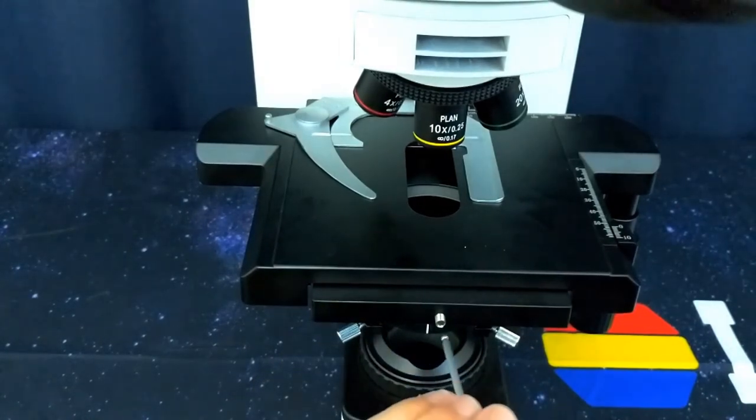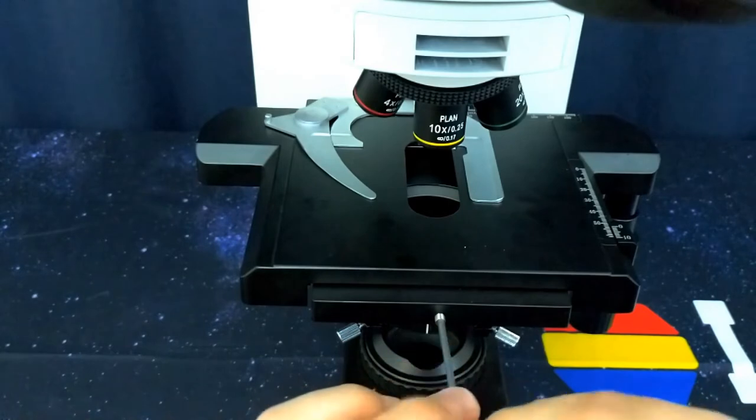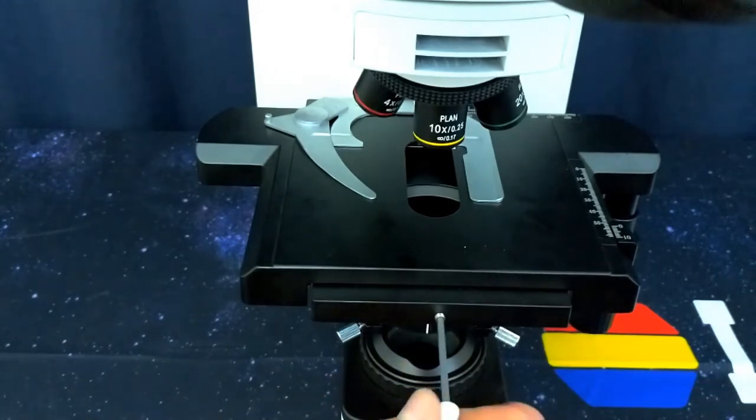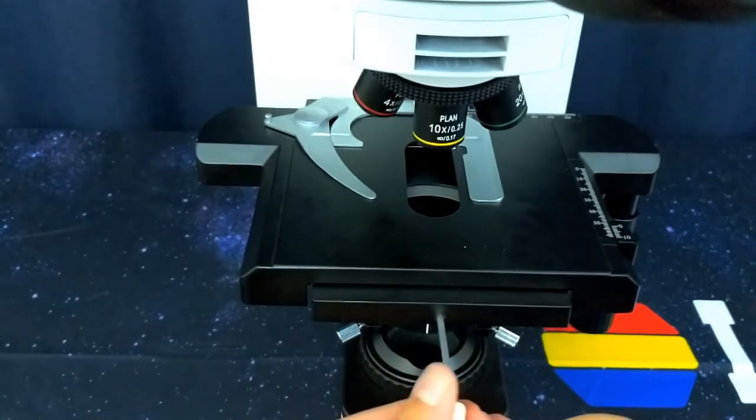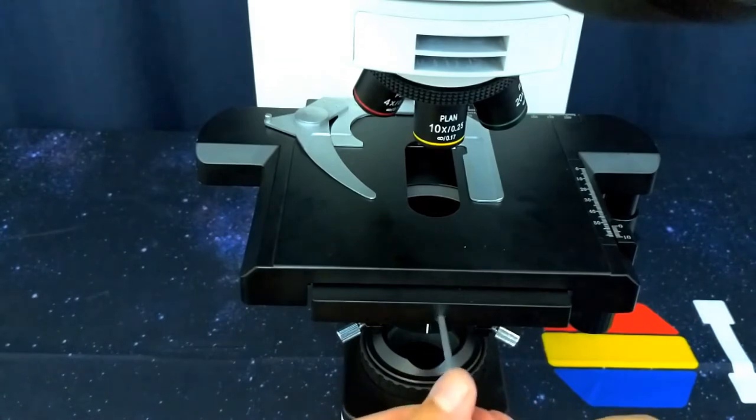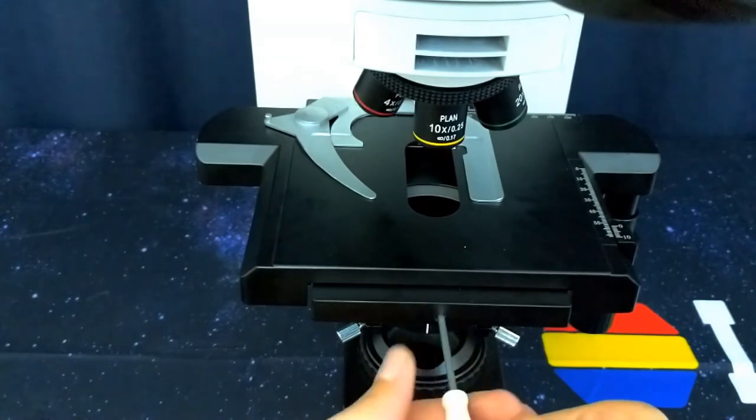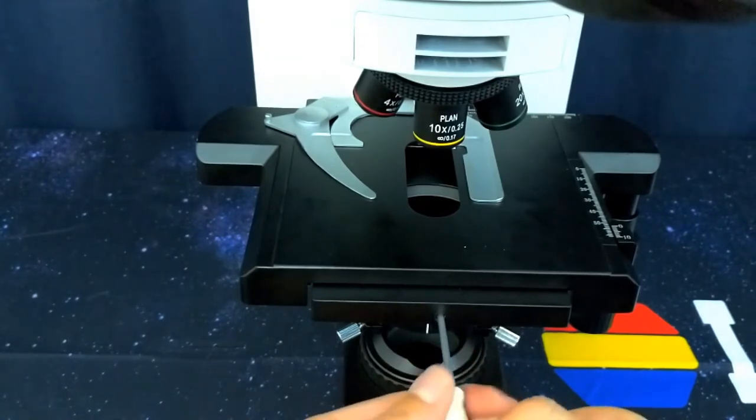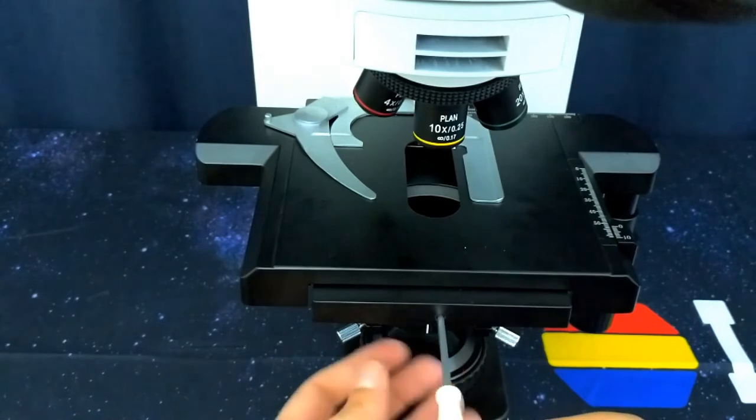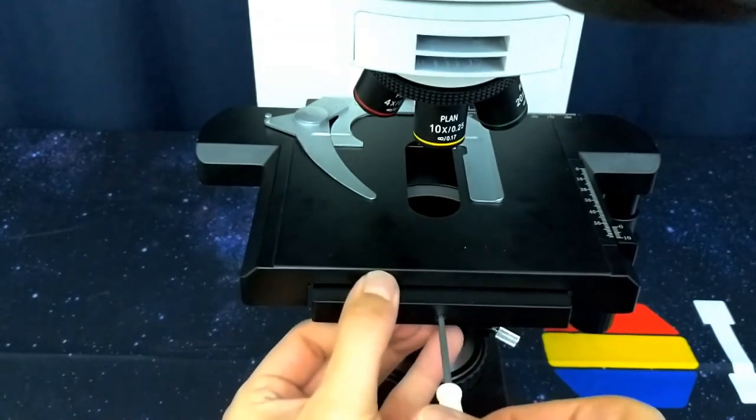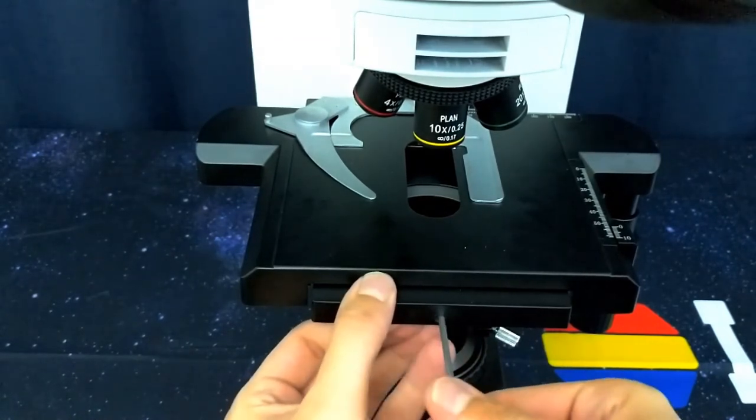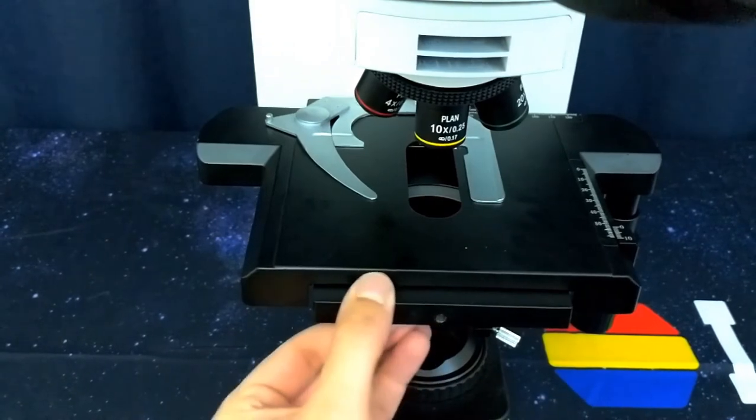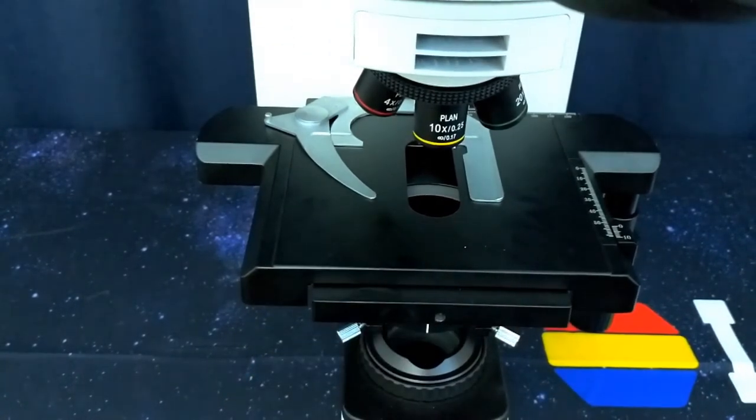Using your hex Allen tool, adjust the stage set pin clockwise to tighten the stage onto the stage mount. This may take several revolutions of the Allen key. Once you feel the stage starting to contact the stage mount, pull forward on the bottom of the stage and tighten the rest of the way. Ensure the stage is stable.